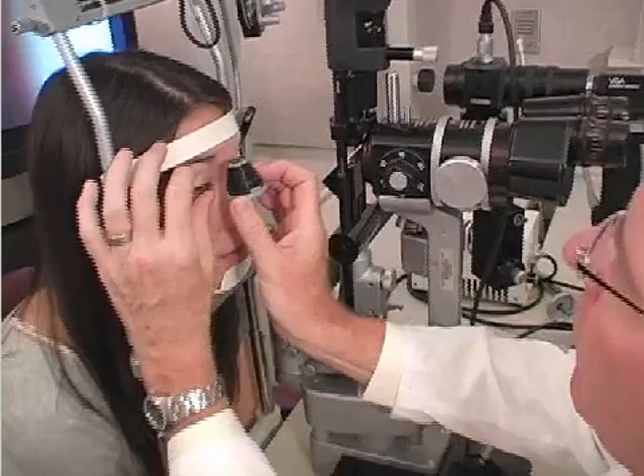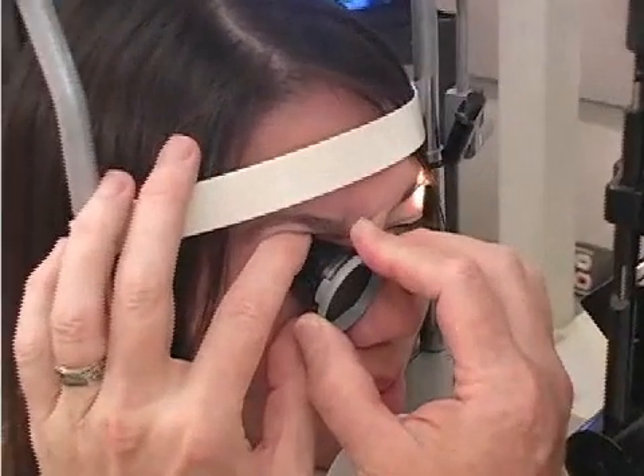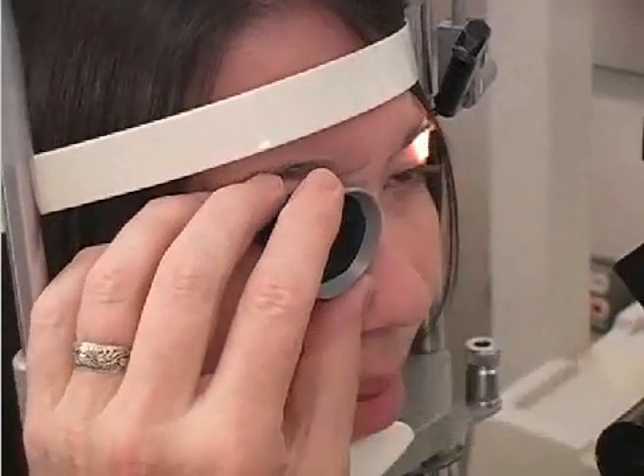The patient is instructed to look up, and the inferior part of the lens is placed against the lower portion of the globe. The lens is tilted up, and the patient is instructed to look straight ahead.